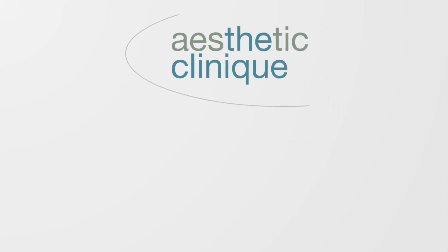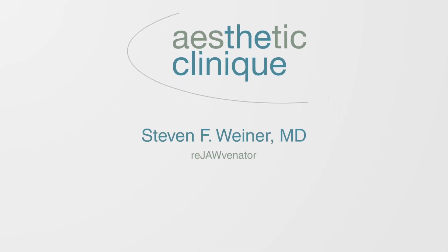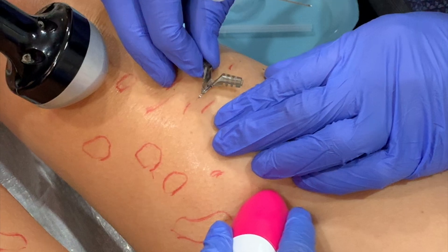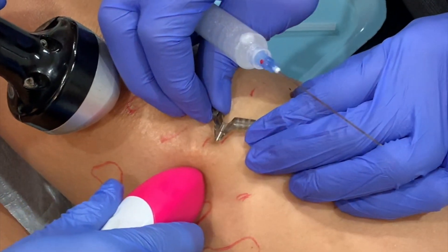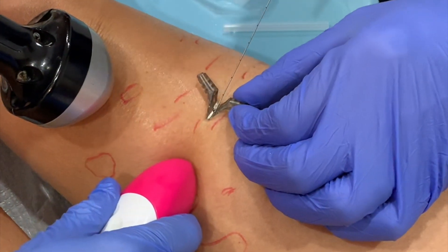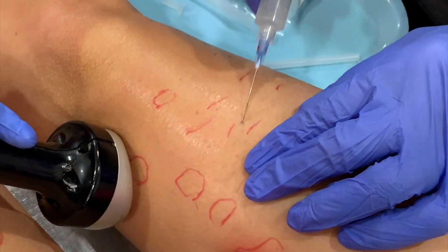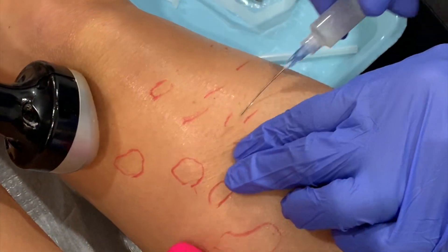This is Dr. Steven Weiner, and I'm going to discuss how I treat cellulite of the anterior thigh using Sculptra. I mix the Sculptra in a 16 to 20 cc dilution with a little bit of plain lidocaine. I use a 70 millimeter cannula, that's 23 gauge.